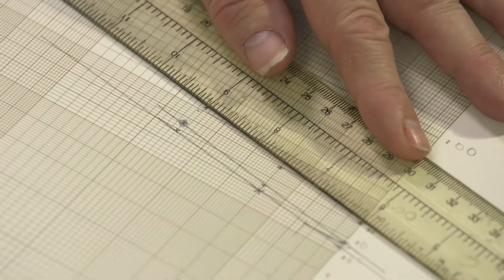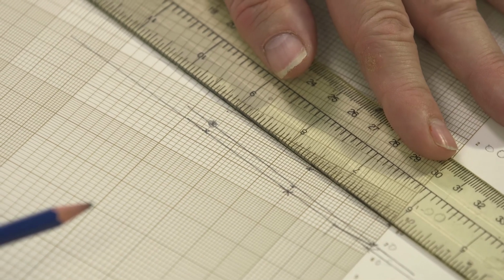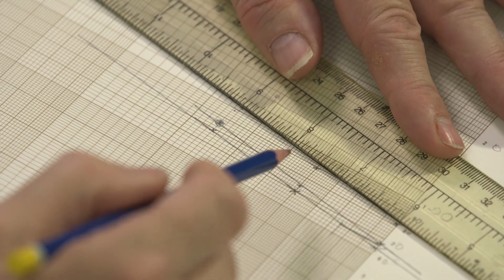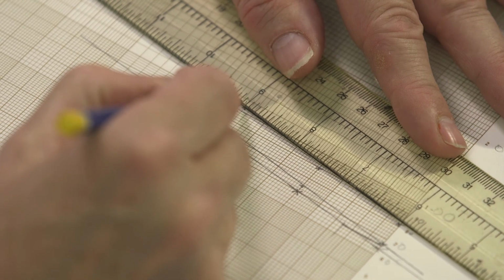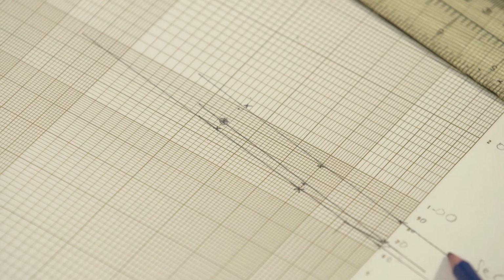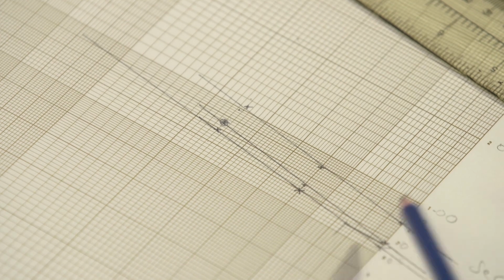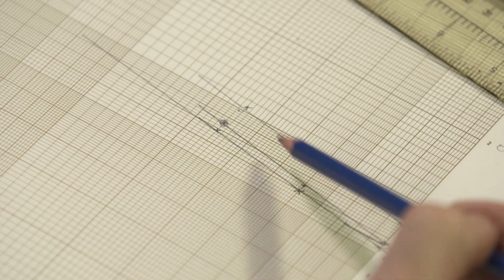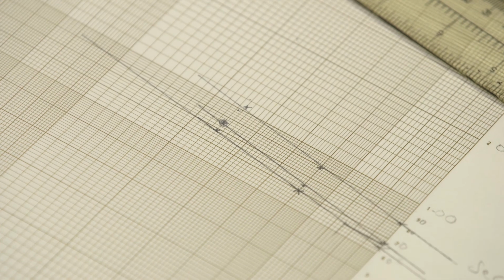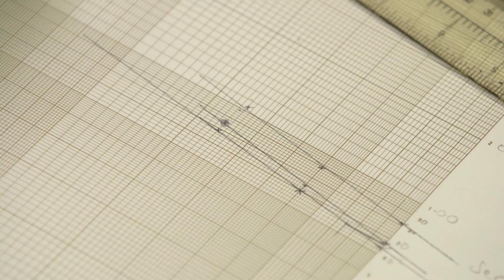Is it a straight line? Yes, pretty close. A straight line parallel to the standard. We put the line of best fit, done visually. It's a straight line relationship. It's parallel to the standard. It meets the criteria for a valid assay. Are the clotting times exactly on the line? No. This is perhaps a second above. This may be a second below. And this is typical. But overall, straight line, parallel to the standard.